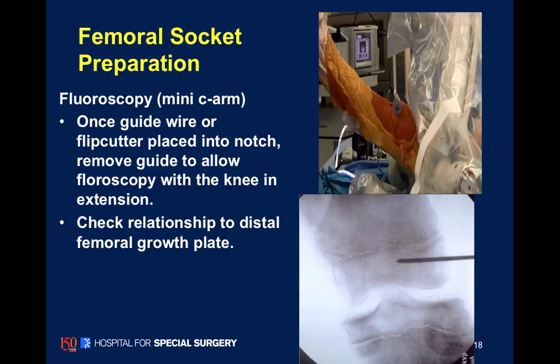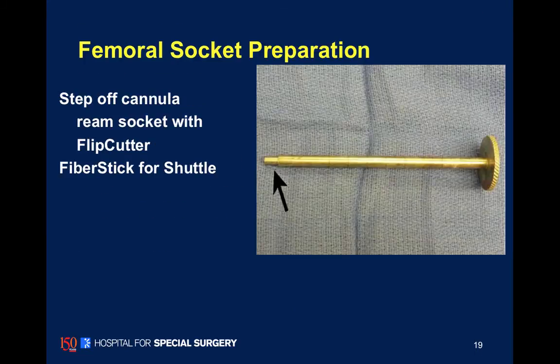We use arthroscopy to pick our insertion point within the knee, and C-arm to help judge our relationship with the distal femoral and proximal tibia growth plates.